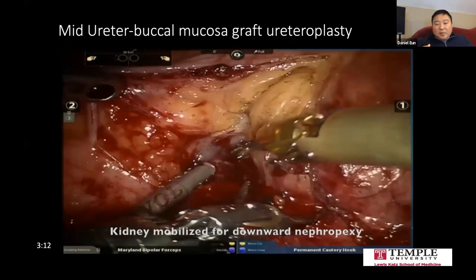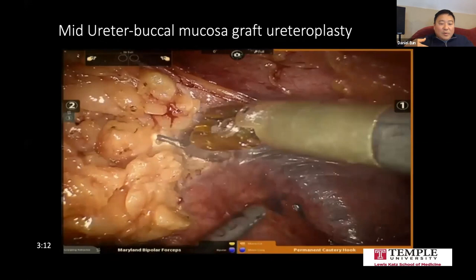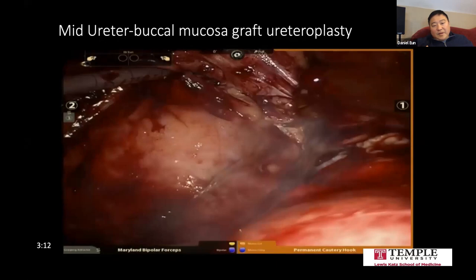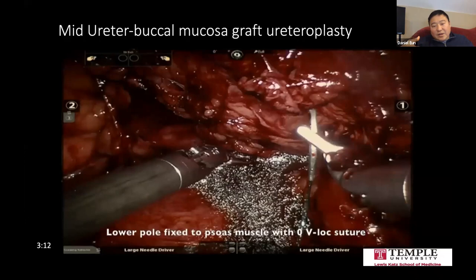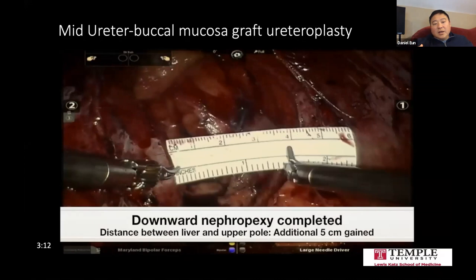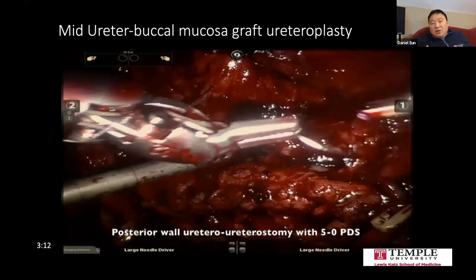So what I'll tell you about a downward nephropexy, I've had to do more than my fair share of these so far in my career, is that here we're taking down the nephrostomy tube and getting rid of it. To do a proper downward nephropexy, we're truly mobilizing the entire kidney and able to move it 4 or 5 centimeters down, you really have to commit to it. And it takes about 45 minutes to an hour worth of work, right? To completely free it up, except that it's just on its vessels. So here, there's a 4 to 5 centimeter downward mobility.